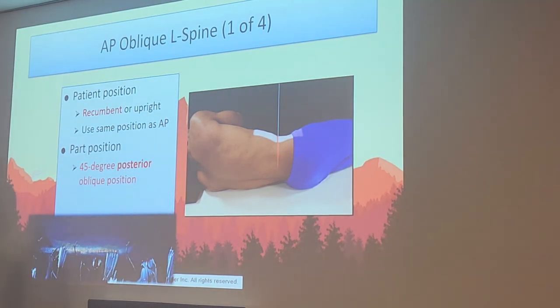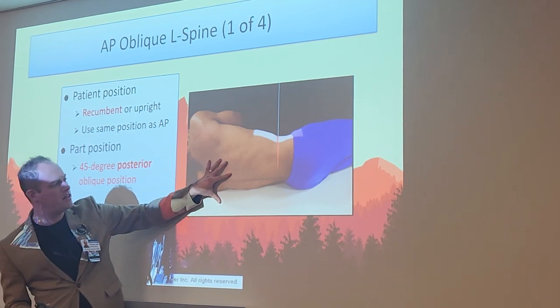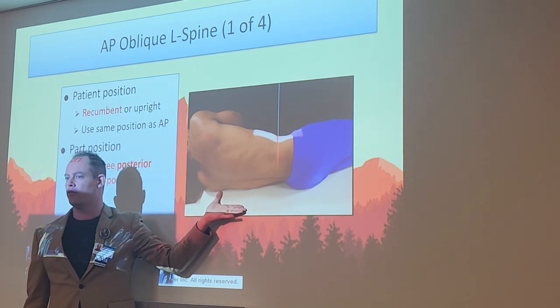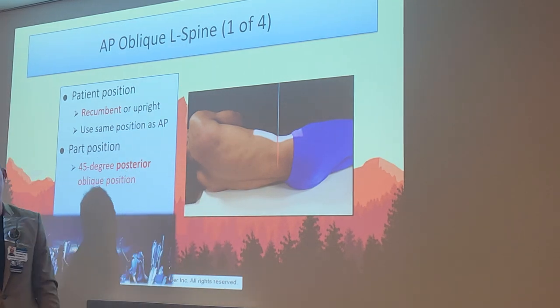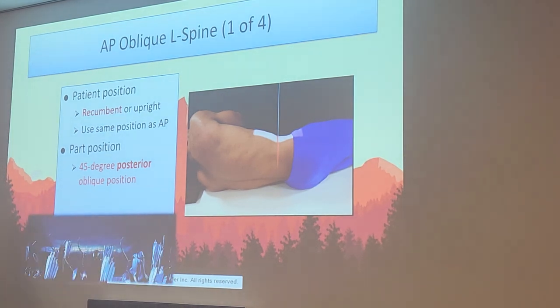Now, if your facility has those triangular sponges, have any of y'all used the sponges? That is a big help to you for getting them in a nice true 45 degree oblique. If you don't have it, you have to kind of eyeball it a little bit. They're not using a sponge here, but if you have the wedge sponge, you literally put it behind them, they lay back on it, and they're going to make a 45 degree oblique for you. Can't miss it. So if you have those, I really suggest using them. I always need to learn how to eyeball a little bit. Hopefully they show you both ways in lab.